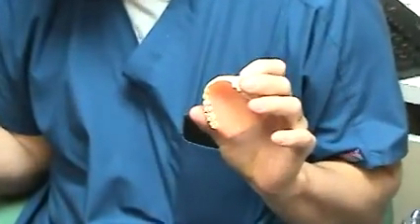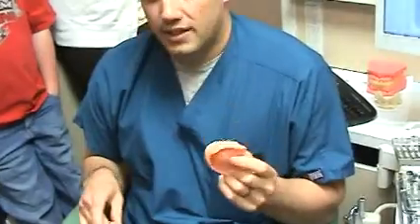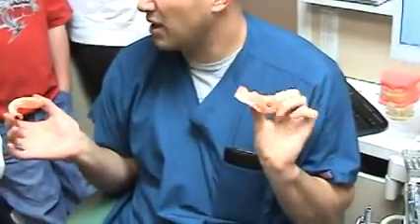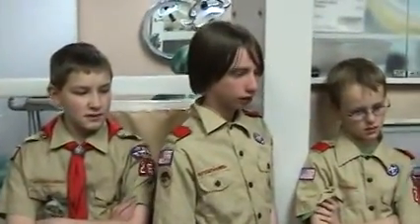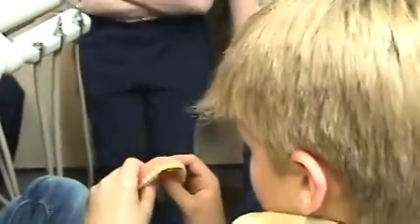That's what these are, examples of a denture. This is a lower denture, this is an upper denture. Okay? So if you see somebody whose teeth look just a little too perfect, they might be dentures. I heard some dentists make slightly offset dentures so they look realistic. You can do things like that. Sometimes patients have those type of requests. Go ahead. All right, just don't drop them. Go ahead and pass those around.